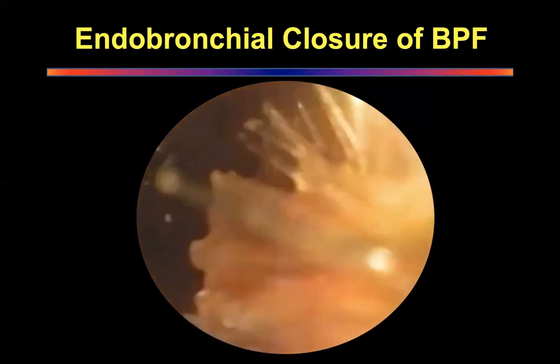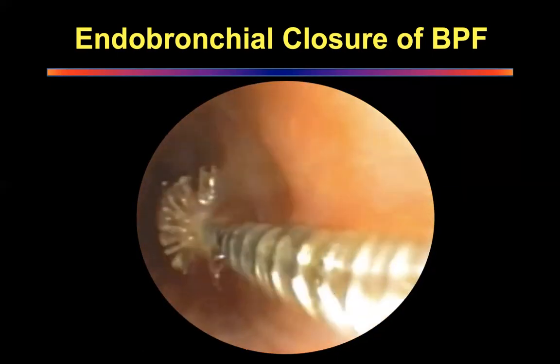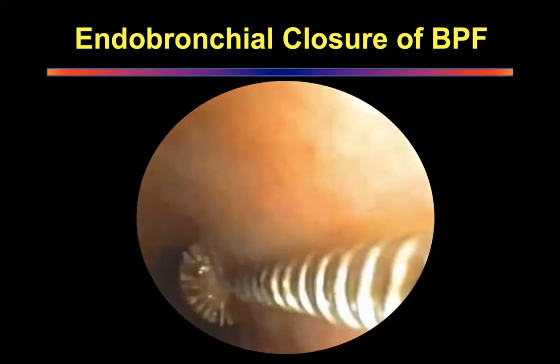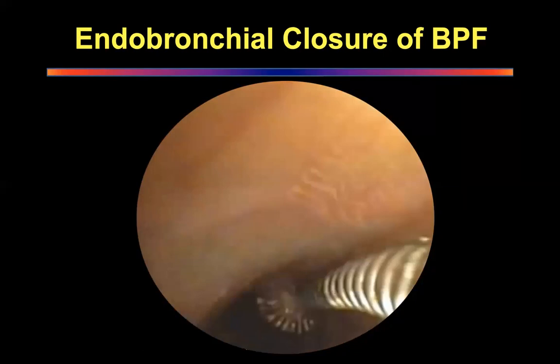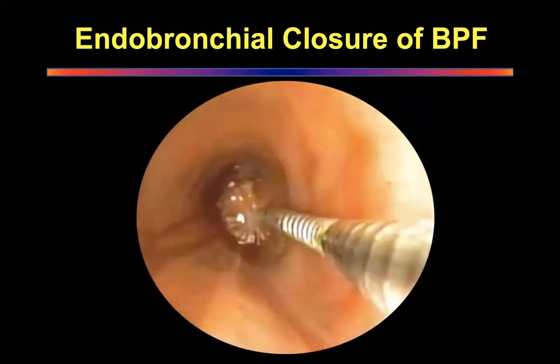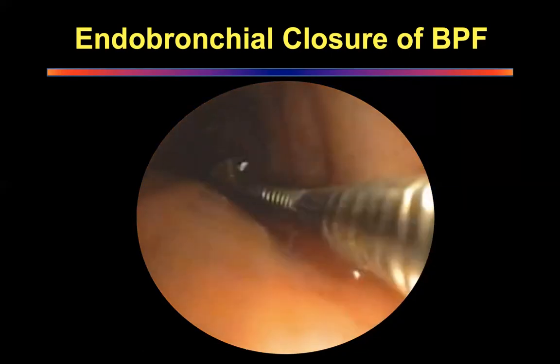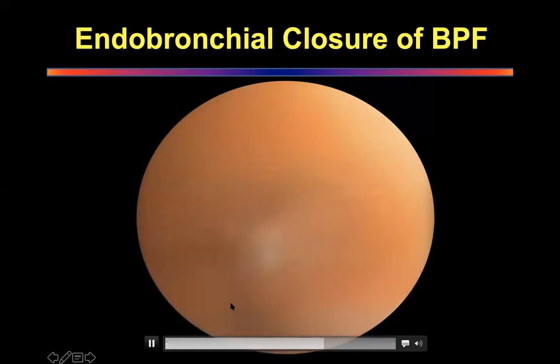And we went in, we sucked it all out. And this is my brush going in there. And I'm actually brushing the mucosa to show you how we do this procedure. So you just create an abrasion on that area so that the glue has some legs to stand on. And then once you've done enough abrasion, you get in there with your glue and you inject it.